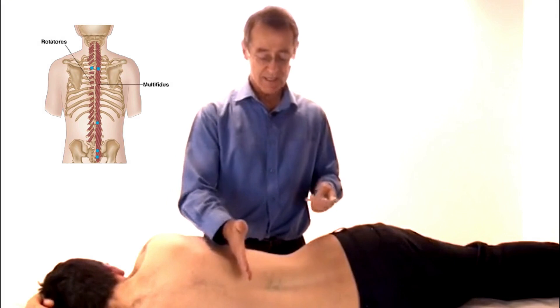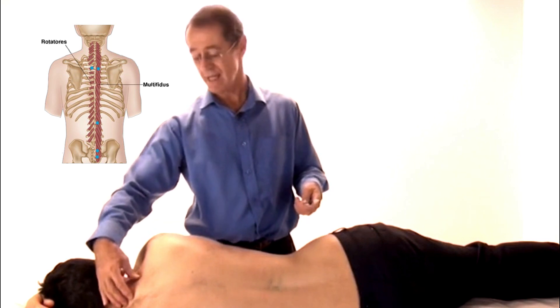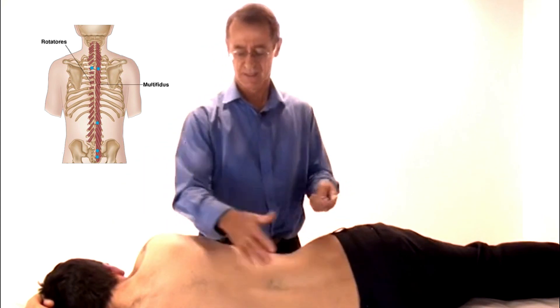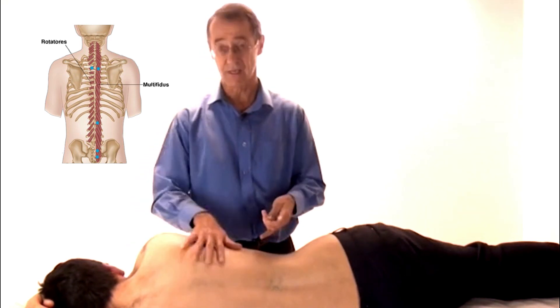I've talked here about treating the lumbar spine, and you can do the same in the neck — the multifidi in the neck — and this is very safe. But when you come into the thoracic spine, you have one other really important structure, and that is your lungs.